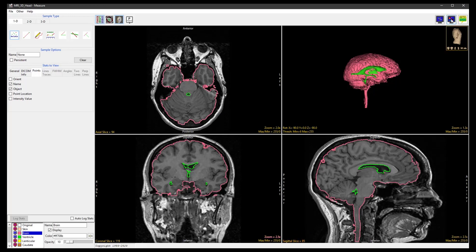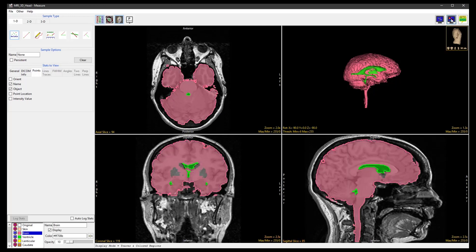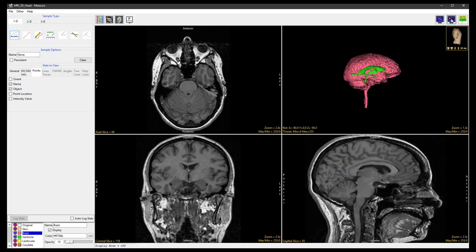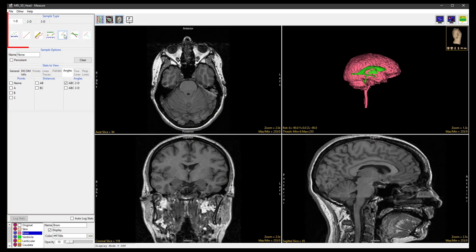Use the Display Mode button to turn off the objects in the Orientation display panels. Now select the 1D sample type and choose the Angles tool.